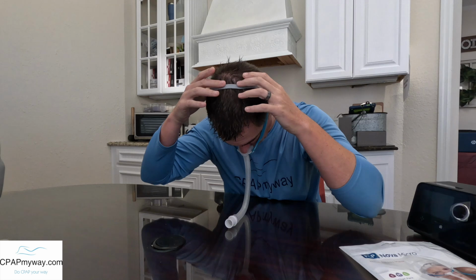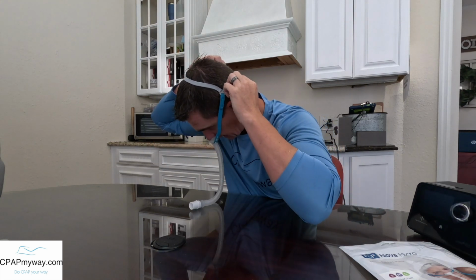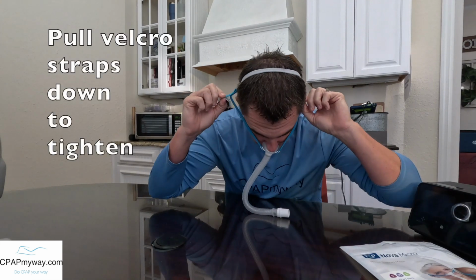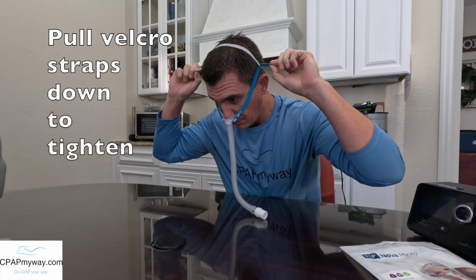And your top strap should kind of rest right up top. Blue strap to the back of the head. Okay? And then as I said, the adjustments on this mask are no longer, well, I won't say no longer. Some masks are up top, but a lot of them adjust from the bottom up. On this one, you'll grab the top, right, each side there, and pull down, okay? And that is a little bit different. There are a couple out there that do that, but there's a unique bit about that I'll point out later on. Okay, and once you do that, I always kind of give it a little bit of a flare on those wings there just to make sure it's set in my nostrils, okay?